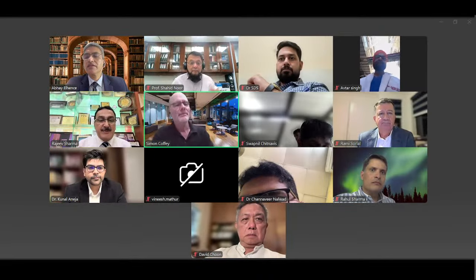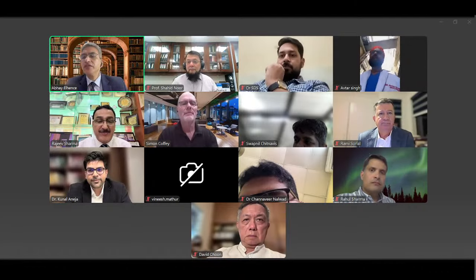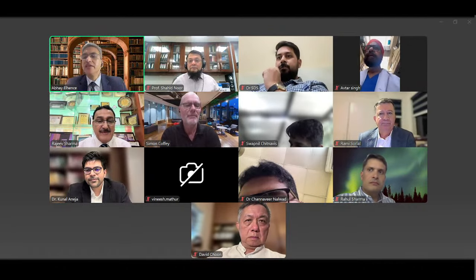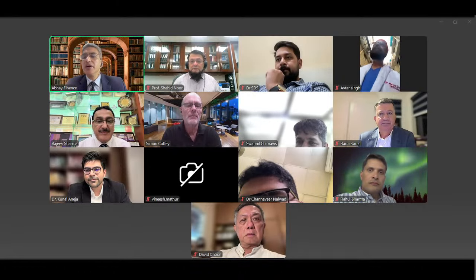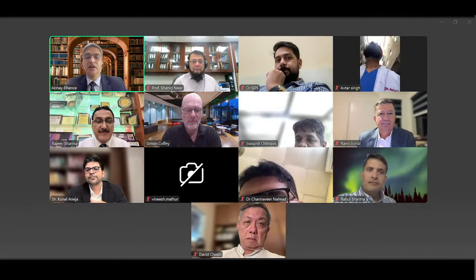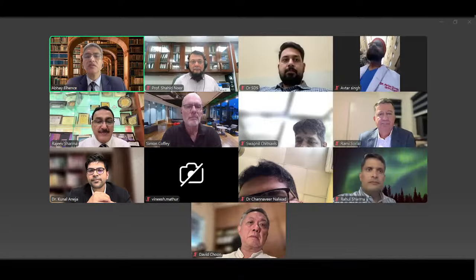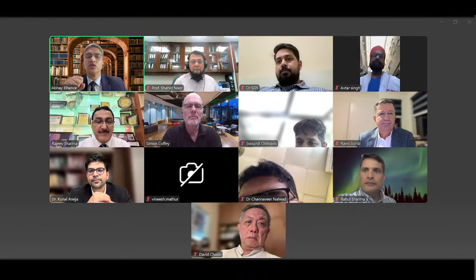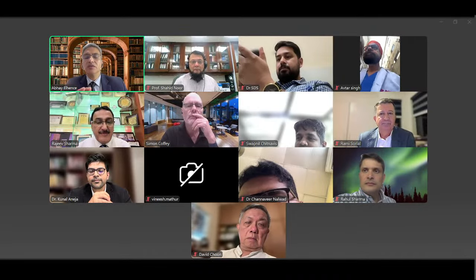Great. There is a similar question from Prof. That technically, what is the ideal required number of impactions and the force needed per impaction to seat a head on the taper of the stem? So I think Kunal has answered that adequately. It's 4 to 14 kilonewtons, which means a single strong blow or maybe a secondary one blow.